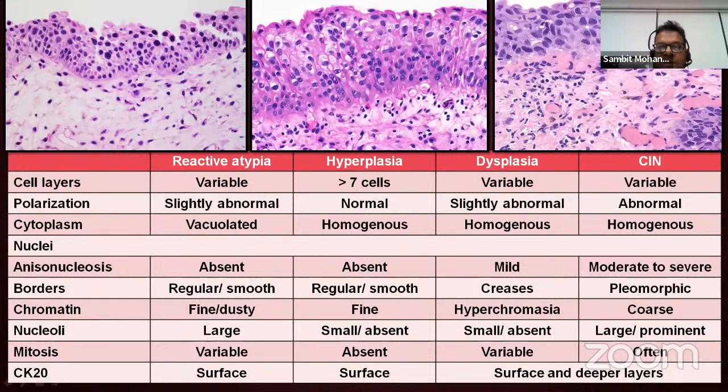Why? Let's see the nucleus. This is a flat lesion. Try to avoid the word urothelial dysplasia. I'll tell you in a minute why. If you see here, you have these nuclei. The orientation is lost. Just pick one nucleus, where the nuclear membrane is irregular, the size of the nucleus is more than 6 times that of the lamina propria lymphocyte. The nucleoli are present, probably visible here, but not conspicuous. And the chromatin is very, very dark and smudgy. So this is a typical CIS.